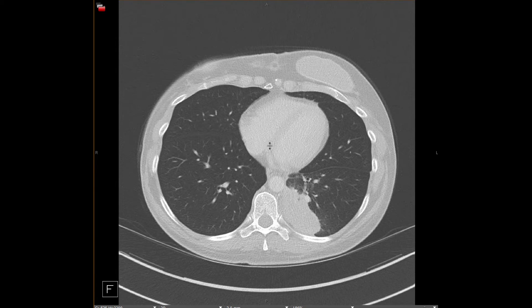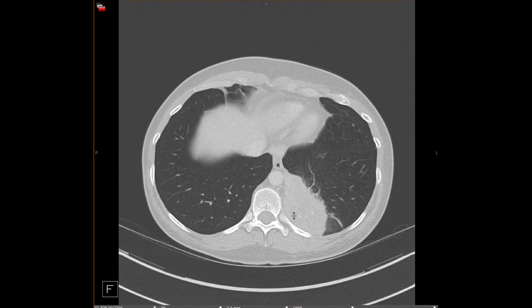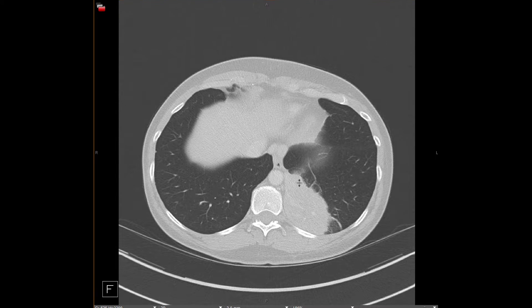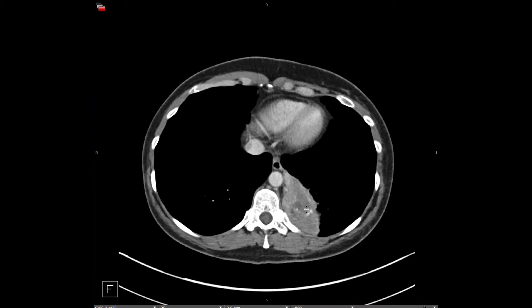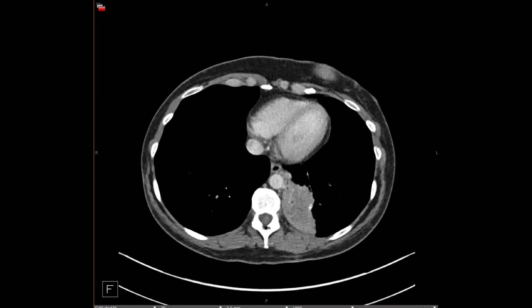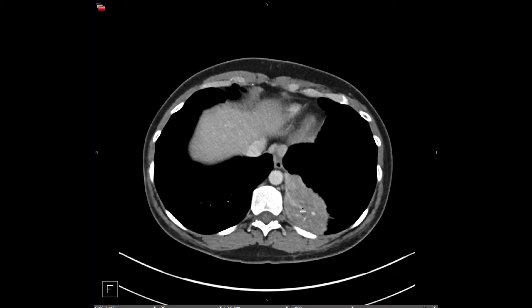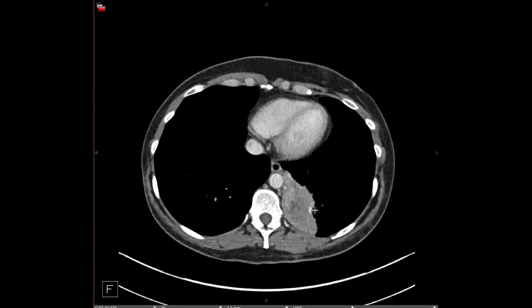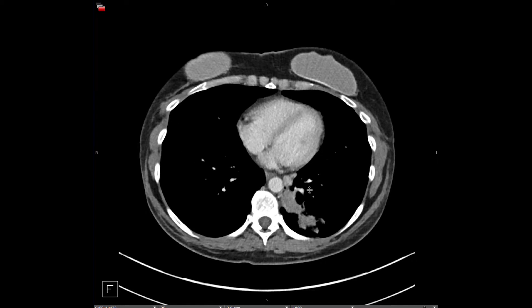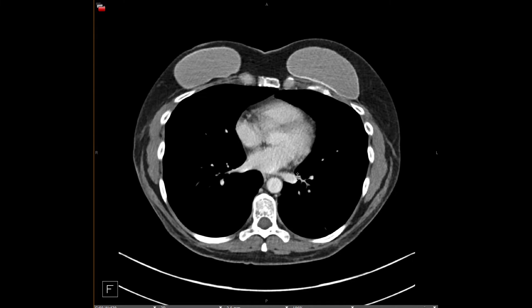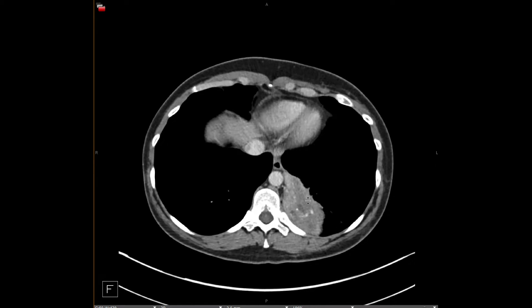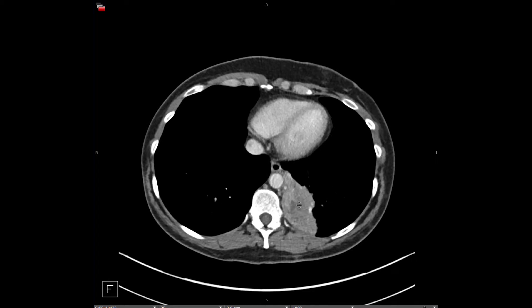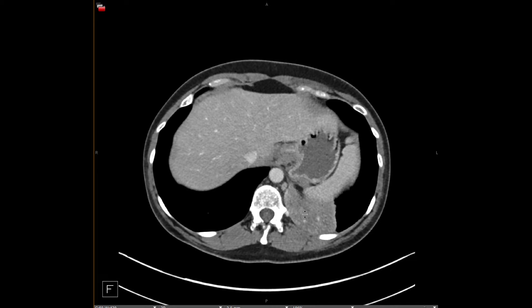Most sequestrations that we see are intralobar. Here again we have a mass-like lesion in the left lower lobe. There is an aortic feeding artery, and we can follow multiple pulmonary veins back to the normal pulmonary vein — so this is an intralobar sequestration. You can also see a little bit of mucus-impacted bronchi in the center of this lesion.